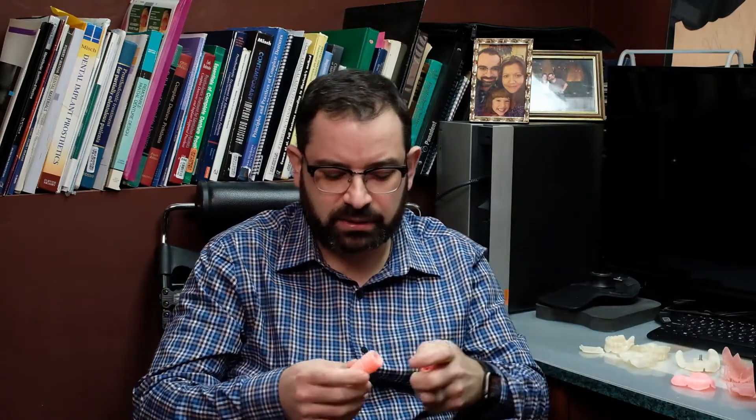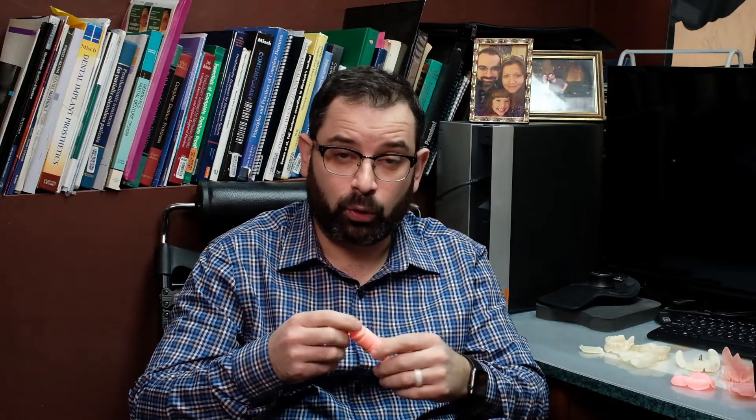I don't know if I just got lucky, but the prints were actually coming out pretty good. I got to print little things like this — not a dental resin — in that little $250 printer. Pretty good quality, pretty exact dimensions. So I started from there.